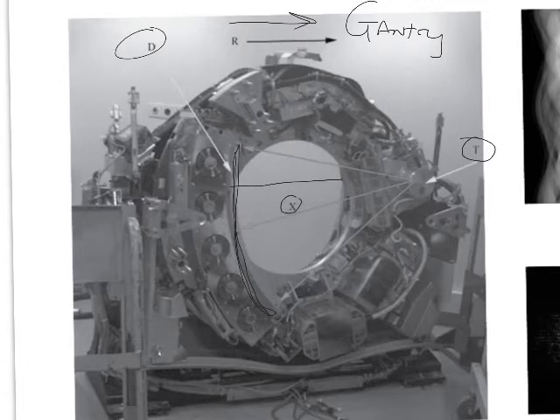This area inside the donut hole is the gantry aperture. The center point there is isocenter for the CT machine. And it's a very important point for the CT machine. What it does with the information centers on that point. I can't stress that enough. Not enough technologists understand how important that imaginary point is. So that is our isocenter for the gantry.